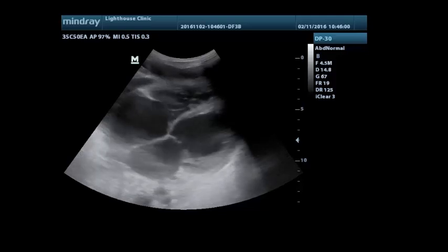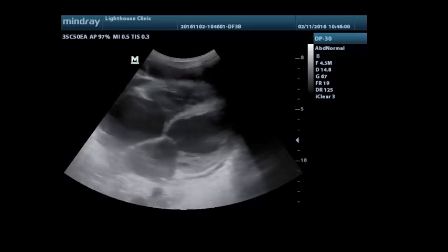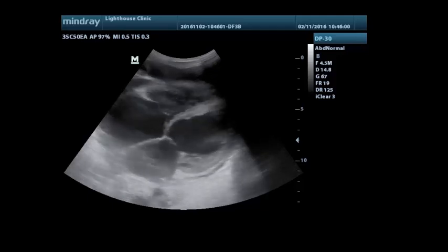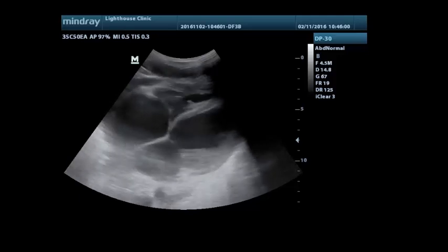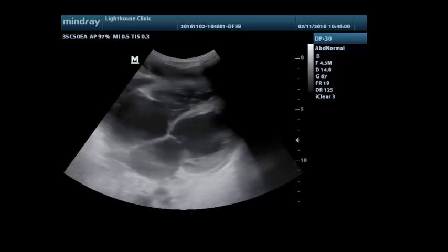And one thing maybe to mention, and this is of course important for her, is postpartum cardiomyopathy. So in this case, 1 month after delivery, this is highly likely to be due to the pregnancy and being postpartum cardiomyopathy. But the sonographic image does not differ between all these etiologies.